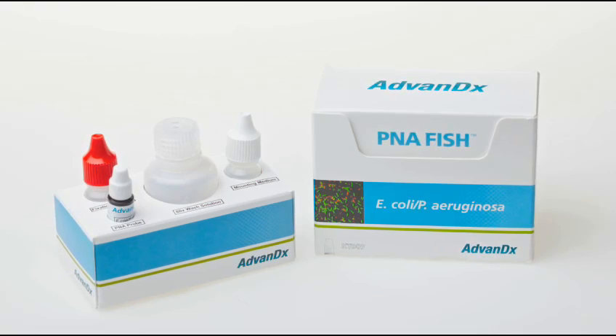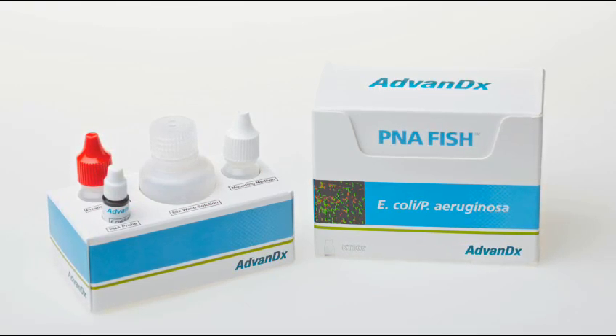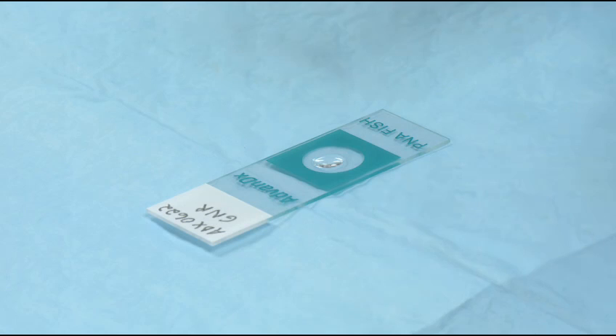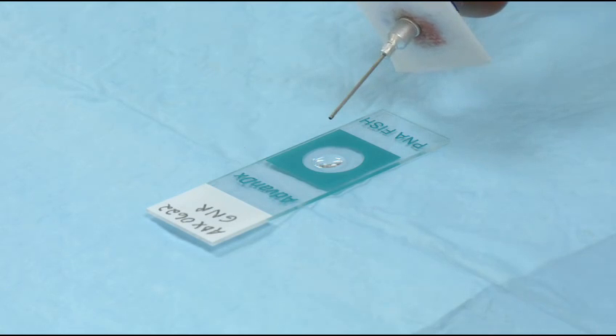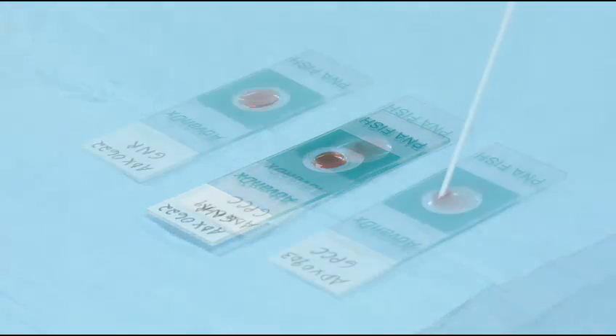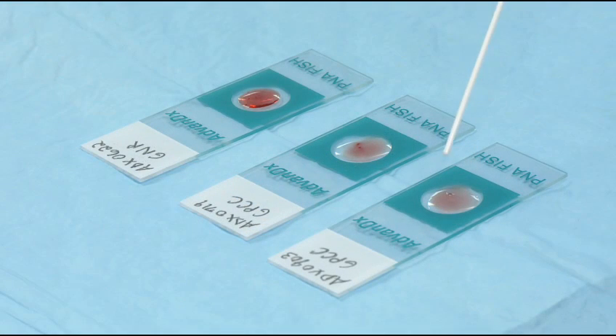If testing gram-negative samples, be sure to use the GN fixation solution — the GN fixation solution bottle has a red cap. Then, transfer 10 microliters, or one small drop, of the blood culture to the drop of fixation solution.